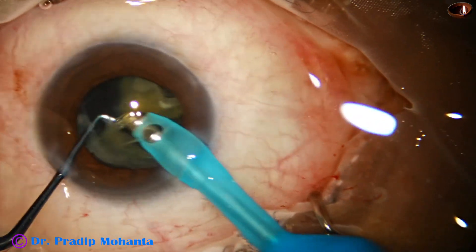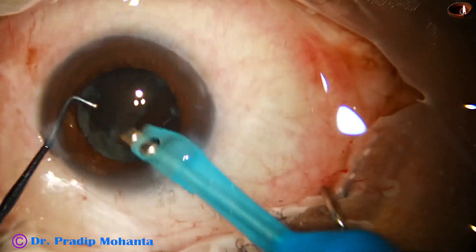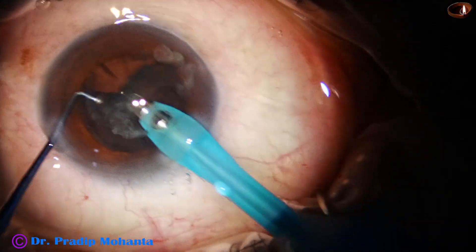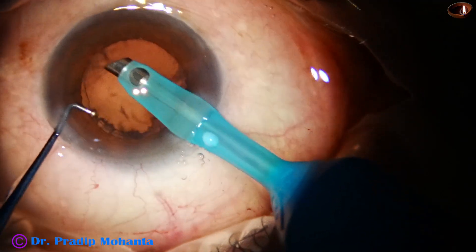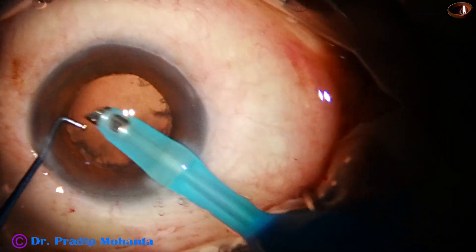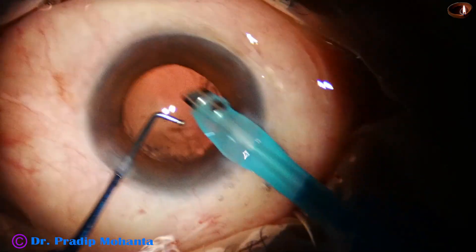And now, this is the contact lens concept. For the last piece, and for the other pieces also, we can do this. I detach the epinuclear shell and remove the last piece. Then, going to a little lower vacuum, I remove the cortical matter.